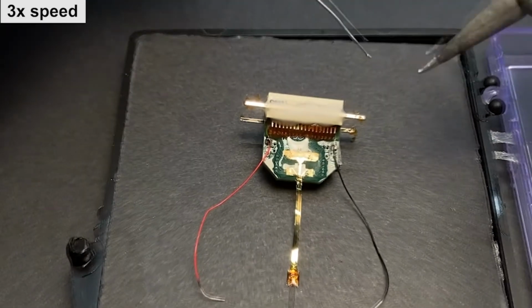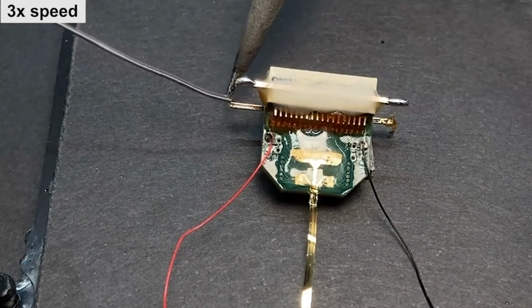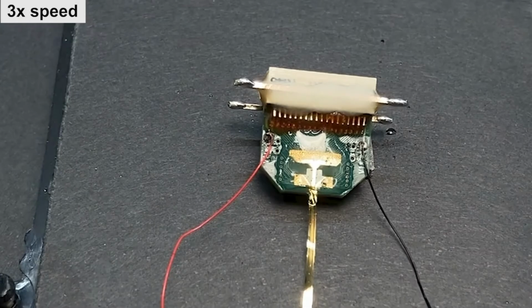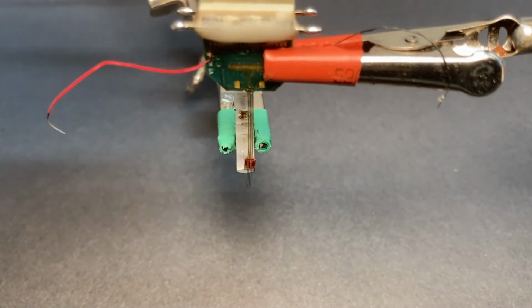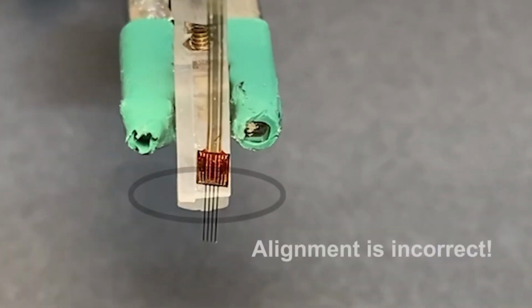So when you are going to solder this to this stereotactic holder and during surgery to the copper mesh, then you don't need to worry about which metal bars you want to use. So once the probe is ready, then we can orient, we can hold the drive with a helping hand, and then with another helping hand move the optoelectrode close to the drive.